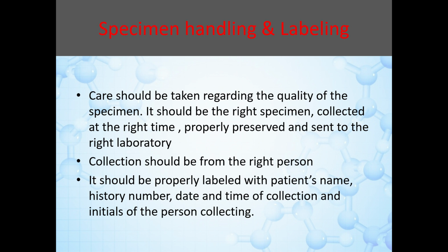Specimen handling and labeling should be done with utmost care, because if you do not maintain the quality of the specimen, then you'll not get the right results. So care should be taken regarding the quality of the specimen. It should be the right specimen first. If the doctor orders for blood, you need to send the blood. You cannot send urine instead of blood.